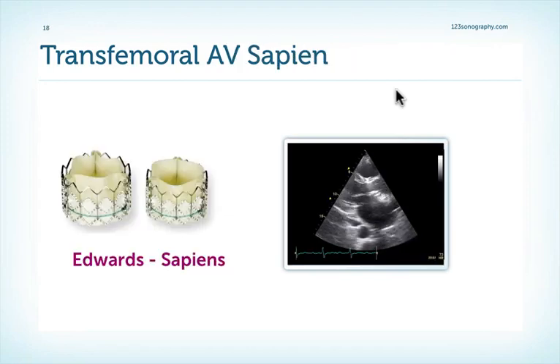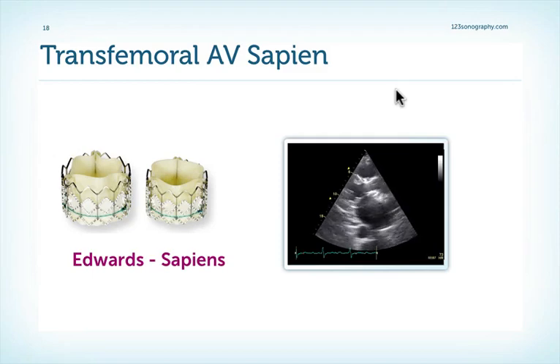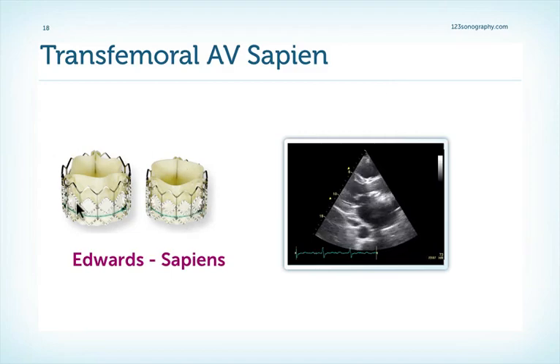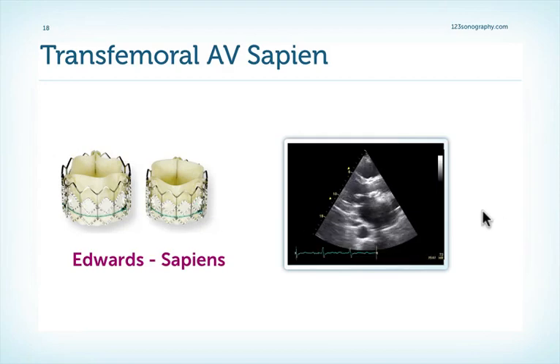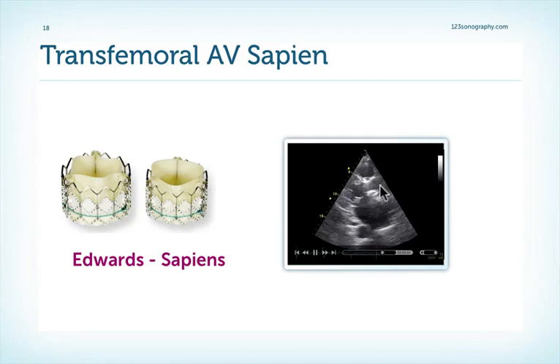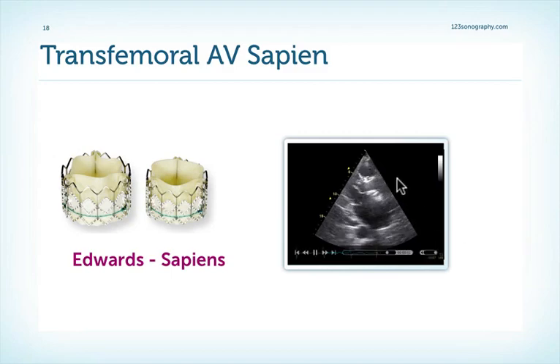The other type of valve currently being implanted via the transfemoral approach is the so-called Edwards Sapiens valve. It looks very similar; the only difference is the stent is not so long, so it looks more like a normal biological valve. We have the stent here in this region. Very often we have fairly echogenic material on the top and the bottom, which is the residual calcified aortic valve, and in between we have the biological tissue.